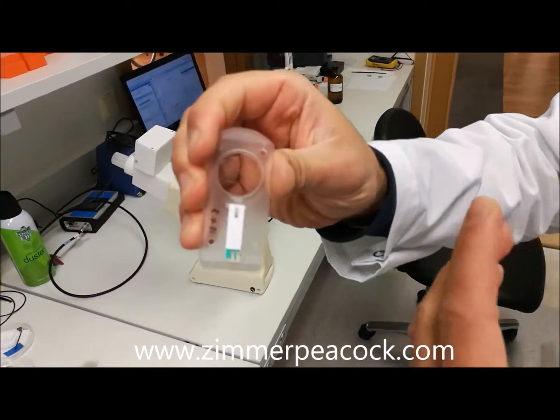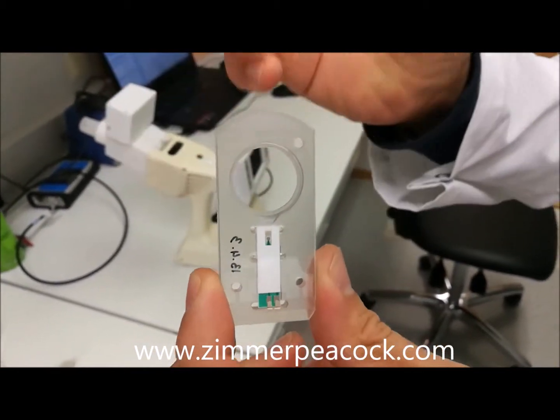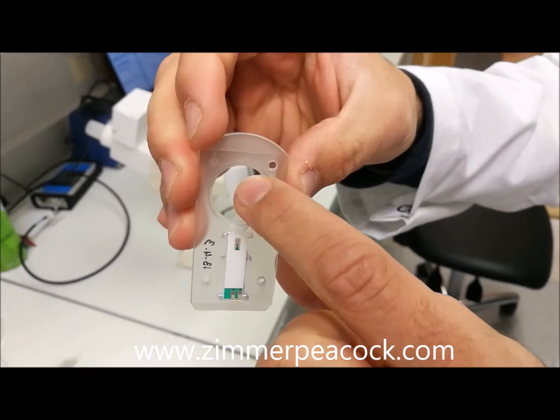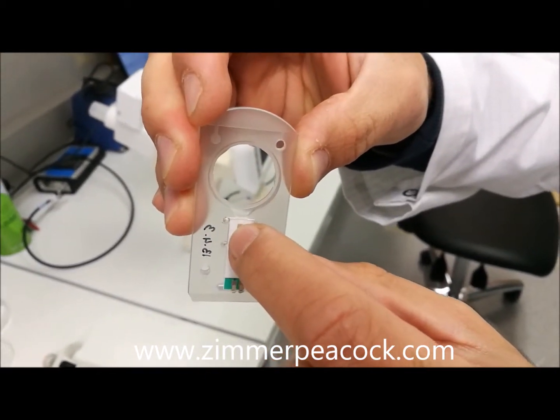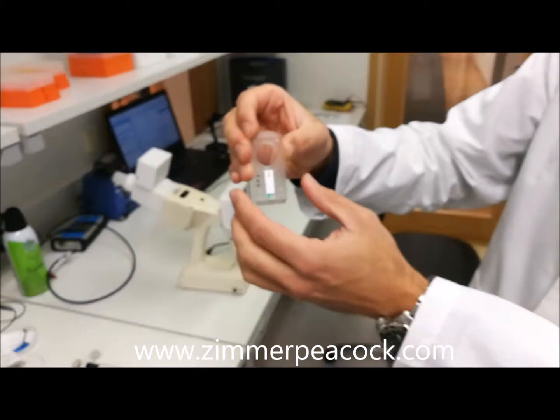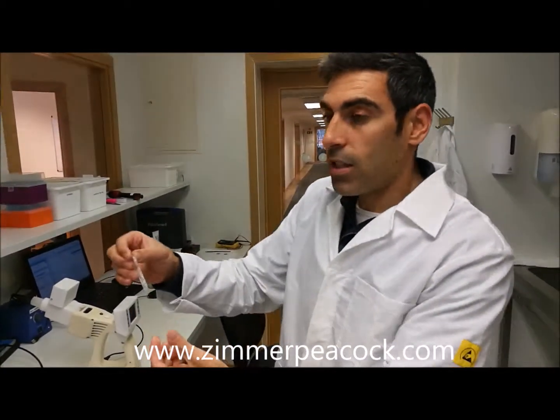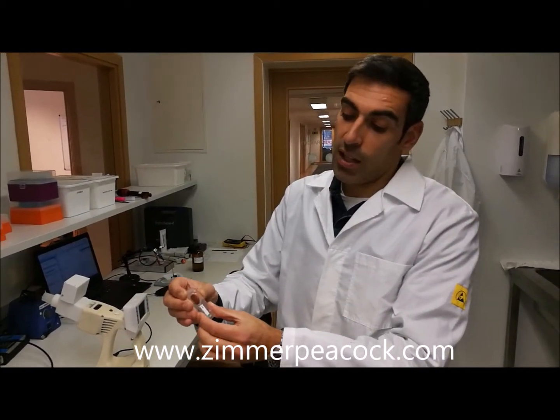We develop sensor cartridges — these are the sensor cartridges. You can see an electrochemical sensor that will detect a specific molecule we are interested in from human breath. The breath will be collected in this area here and will flow down to the active area of the sensor.